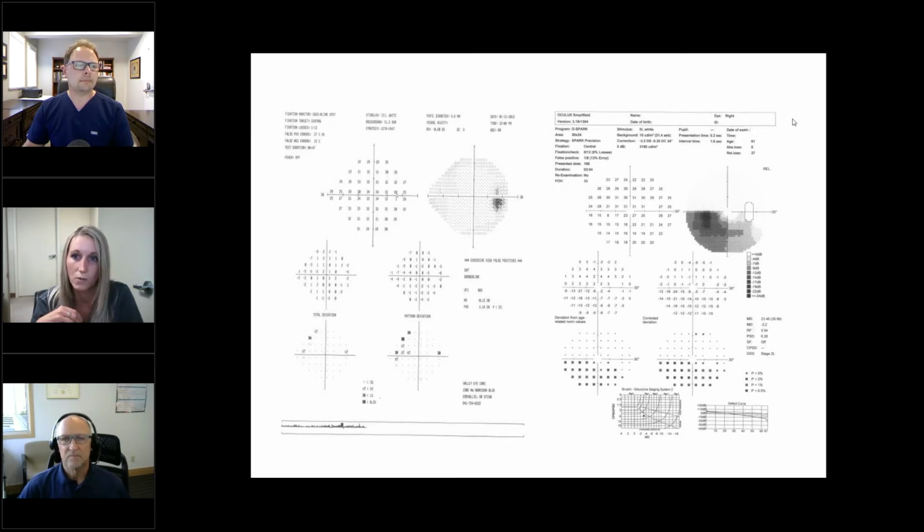They also like to wiggle and move around quite a bit in the Humphrey, and they don't in the Smartfield because their head is forward, it's comfortable, staying put, and it's faster. So I would like to put some input about the two machines and the comfort level and the fixation. Yeah, great point, Brandy. Fantastic.